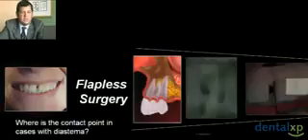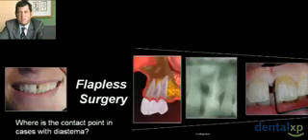And if the interproximal height of bone is receded, if we have a class 2 or a class 3, the outcome becomes even less predictable. In these cases, we are using the natural tooth. After extraction, we hollow the crown and then we reglue it to the implant abutment.